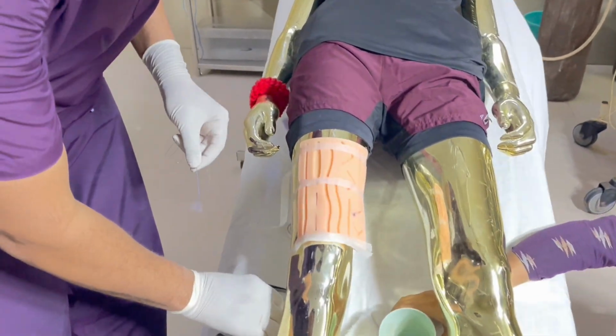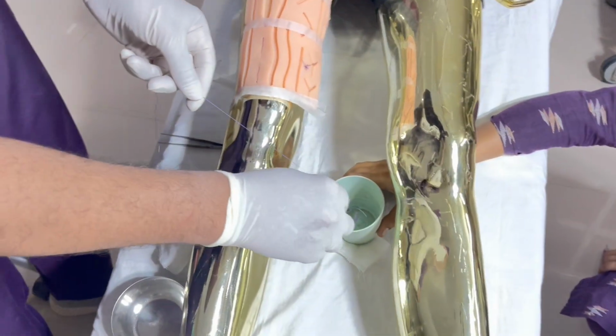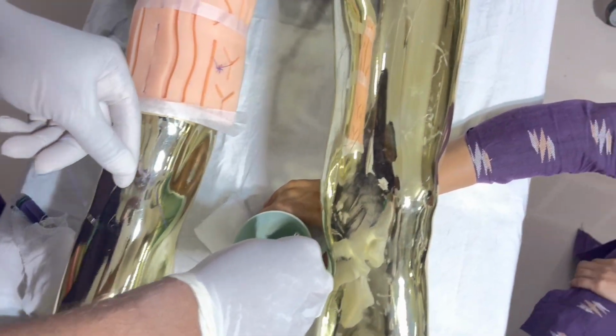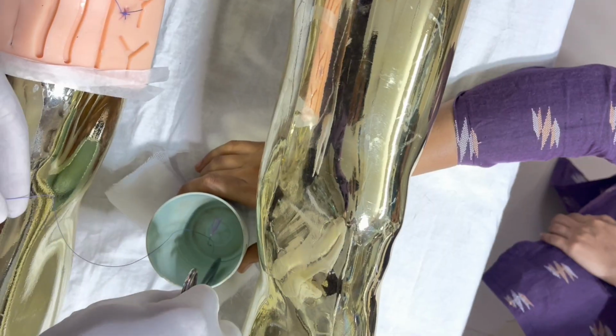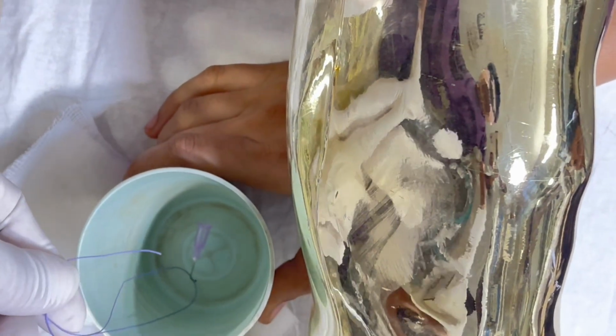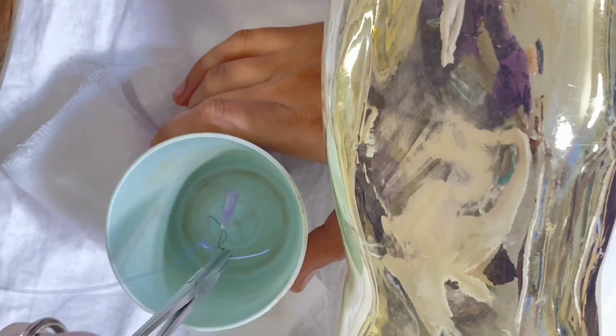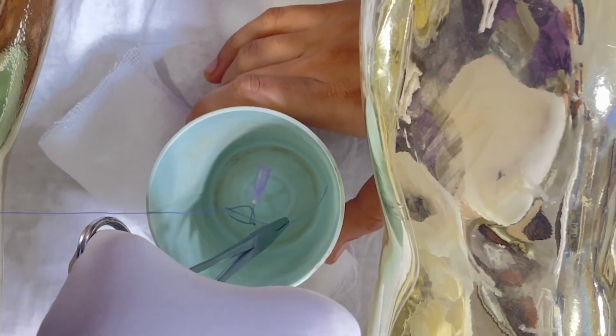If I have to, it is instrument driven, so it will be with the help of instrument, and this is a hook inside, and you have to pass around the hook like this. The hook is attached with the magnet, so I have to take a suture and draw this hook like this.